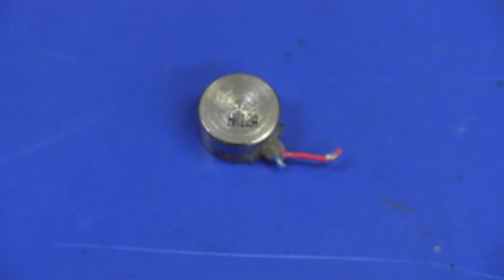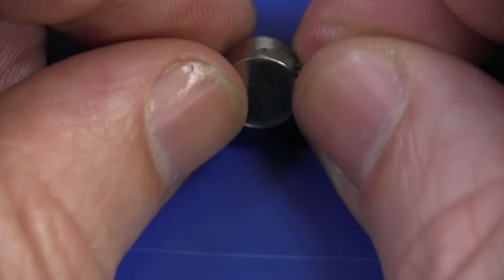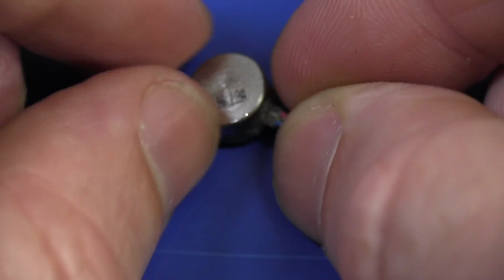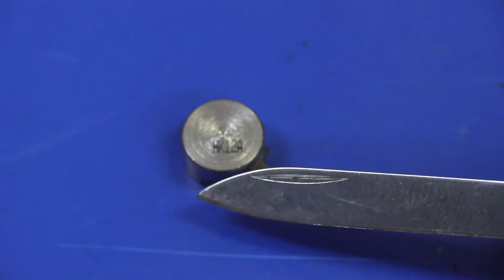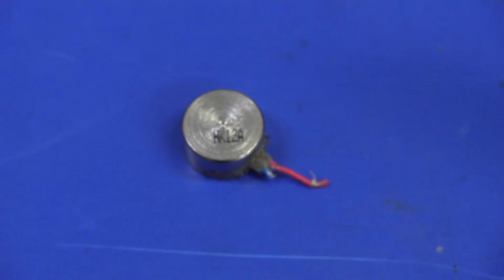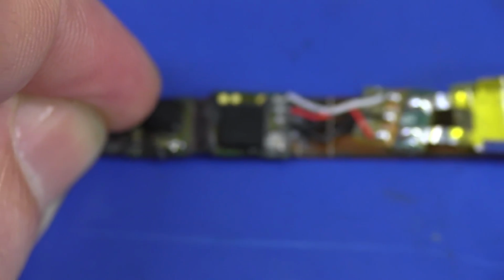Aha, folks, I've been fooled. This is not a piezo ceramic accelerometer like I thought. I was originally quite perplexed why it would have a piezo ceramic accelerometer in here instead of one of the more modern MEMS ones, and so I did a little bit more digging, and this is actually a vibrator. This thing has a vibration alarm in it. Sure enough, I measured the coil in there, 32 ohms. So there you go. The accelerometer therefore must be a MEMS one on that processor board somewhere.